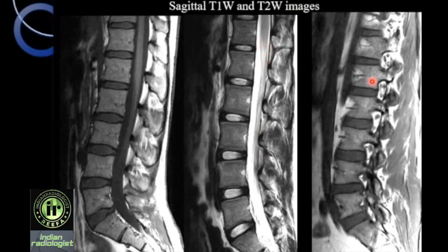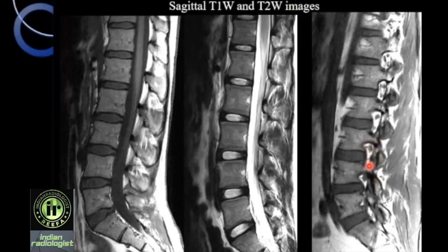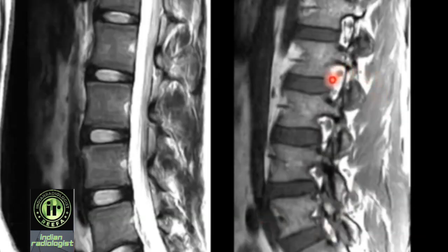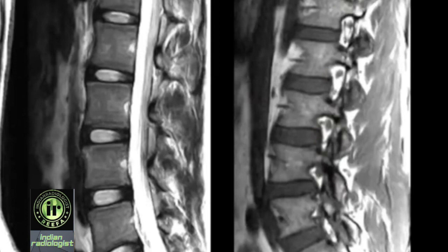This is a parasagittal image, typically about the third or fourth slice from the midline. What we see here is the vertebral body, superior articular process, and inferior articular process. This keyhole-like appearance is the neural foramen from which the exiting nerve root is coming out. This is the pars interarticularis, which is the neck of the Scotty dog. Here if you see it is broken, so this patient has spondylolysis of L5 vertebra without listhesis. Besides the exiting nerve roots, there are two or three small dots adjoining the exiting nerve root; these are venous plexuses which join the paravertebral plexus of Batson with the epidural venous system.